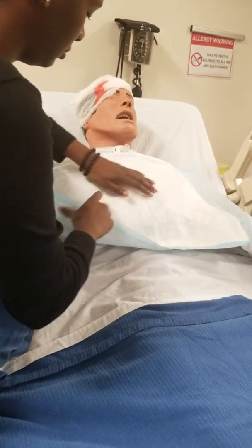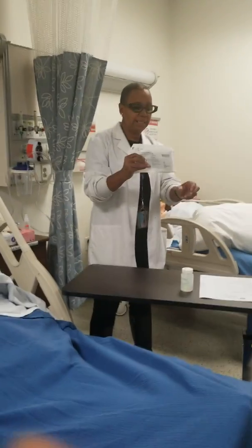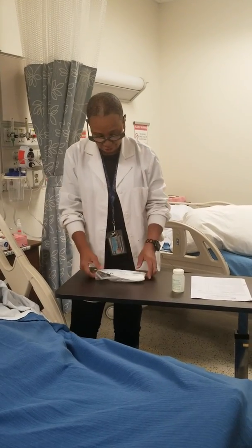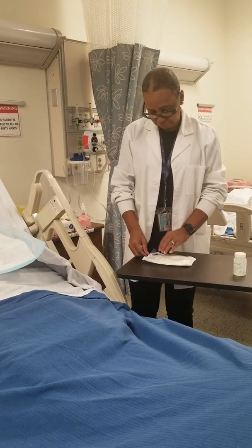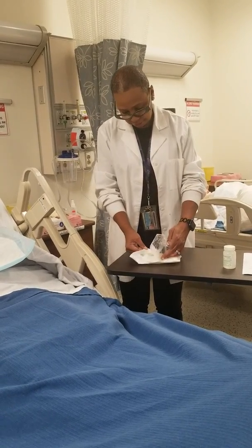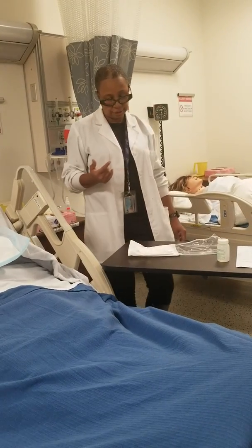Yeah, so your suction catheter kit, let me show you a trick about this. It's going to have in it a pair of gloves, a little box that you put your saline in, and then the suction catheter itself. Depending on how you open this, you're gonna fight with it. The first thing I need is my gloves, and they're at the bottom. So if I turn it over and open it this way, who's on top? Gloves. These things are always gonna get stuck. So watch how you open your catheter kit.